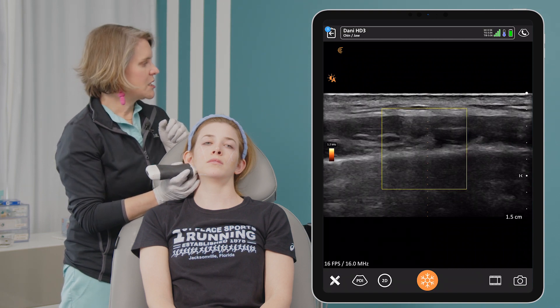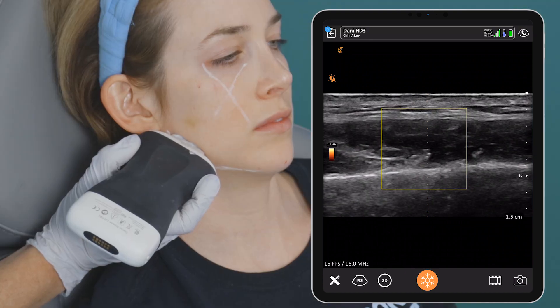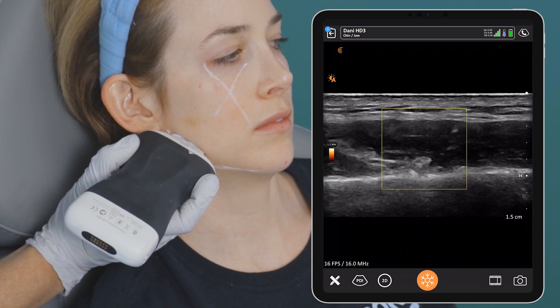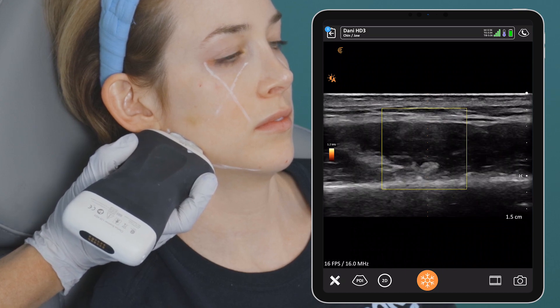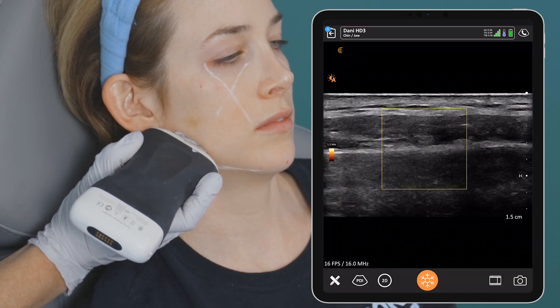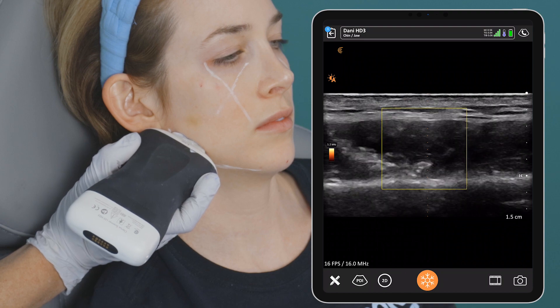Once we are on that spot, I check my pressure. I release the pressure and make sure I'm barely sitting on top of the skin. You don't want air in your probe, but you also don't want to be smushing your view. This is a smushed view — that's a different view than this. You don't want to smush these tiny vessels with the weight of your probe.